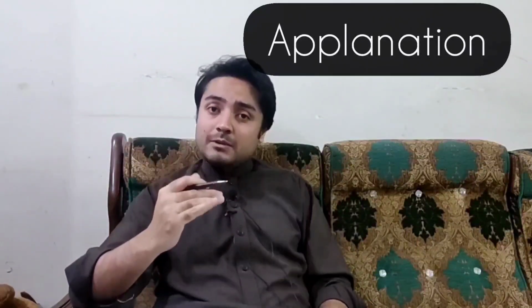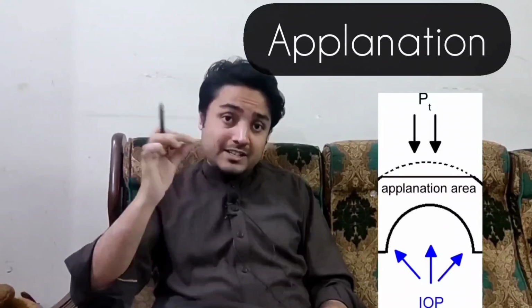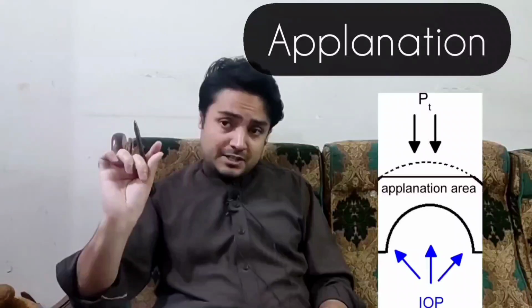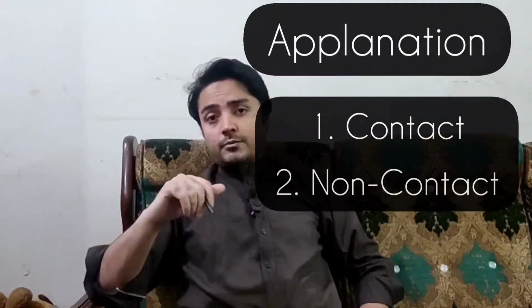Now let's come to the applanation method. The word applanation means the force required to temporarily flatten a part of the cornea. The pressure that the instrument exerts to flatten that part of the cornea is our IOP reading. Applanation tonometry is further divided into contact and non-contact tonometry.